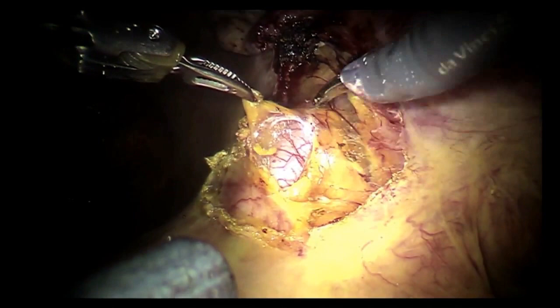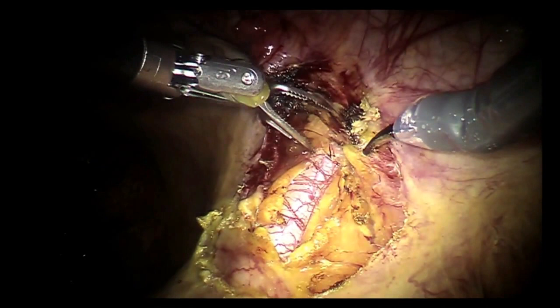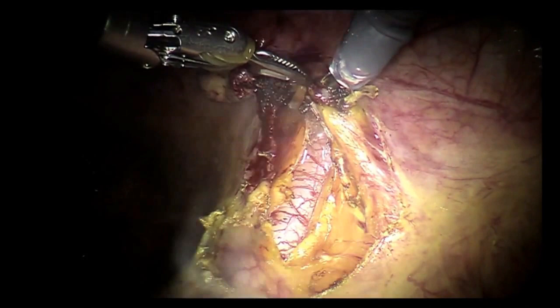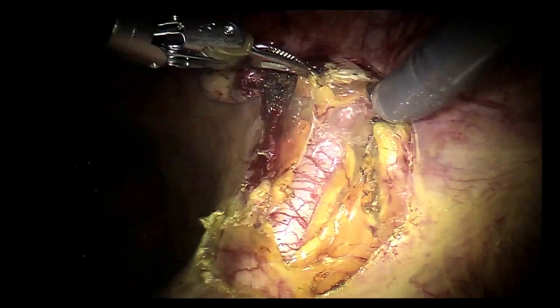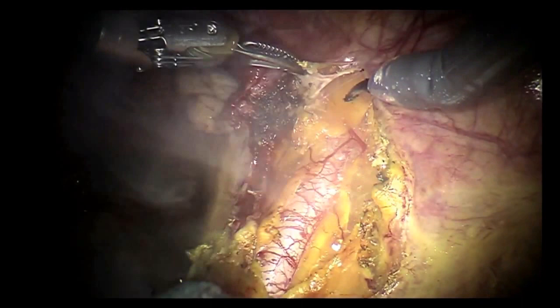Suction just a little bit out of the field. Perfect. Can we turn the room lights down, please? No, don't. Just suction a little bit out of the field. Room lights down, please. Do you prefer a wide dissection or a limited dissection on the artery? Just enough to get the bulldogs on there.